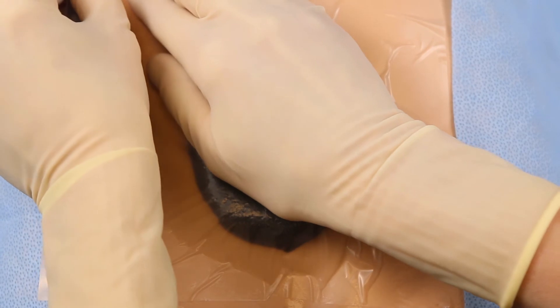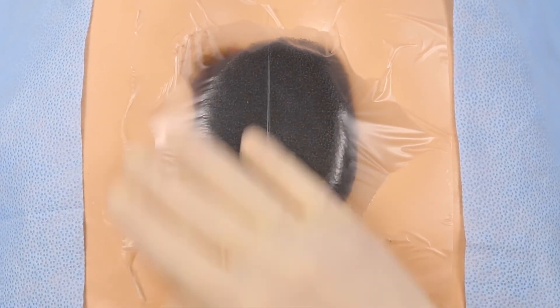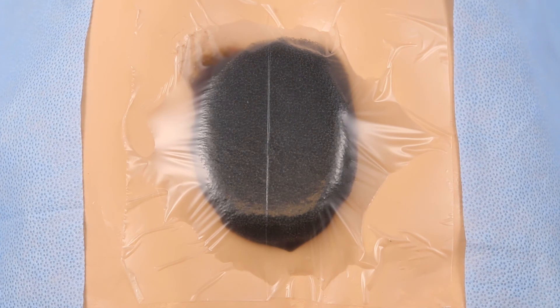Finally, remove the perforated silver-colored handling bar on the side. The transparent film should be adequately anchored to the peri-wound area to maintain an airtight seal.